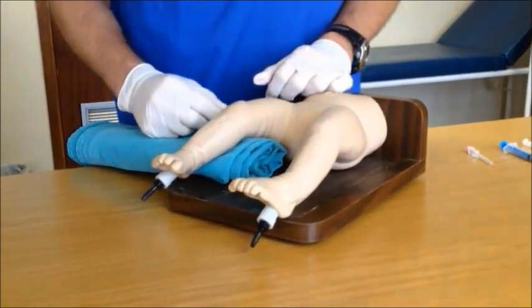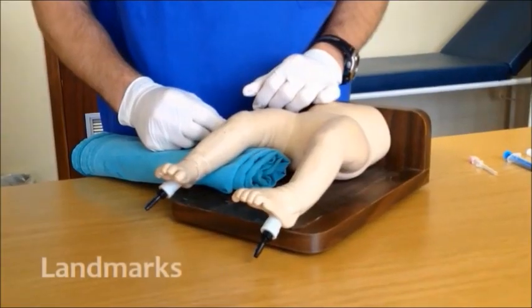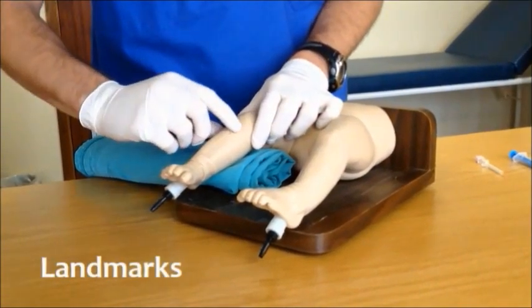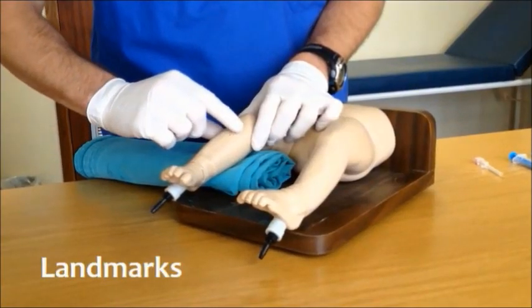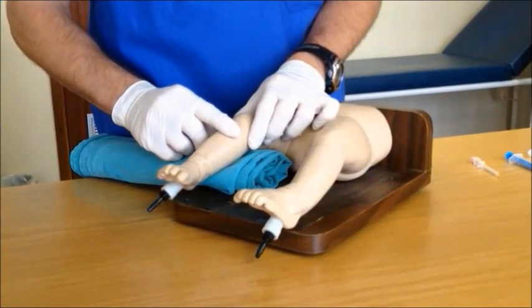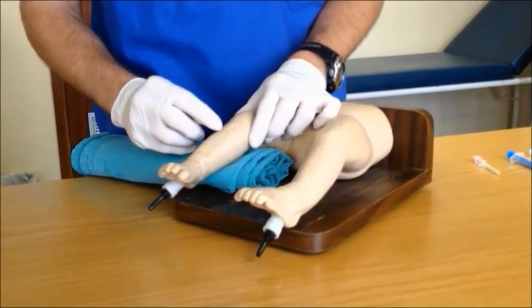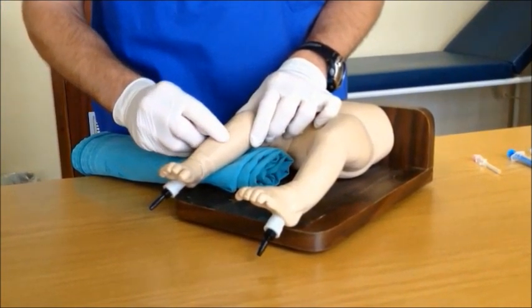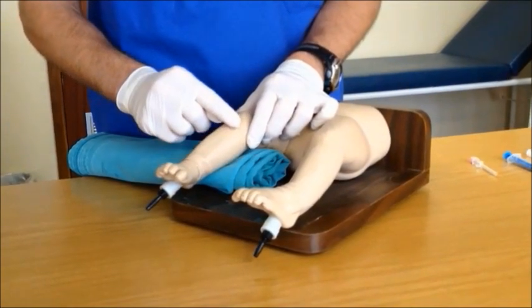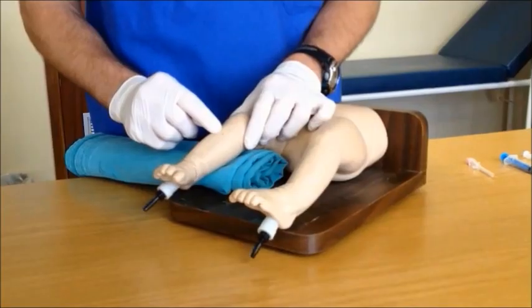The second step would be to identify the correct area of insertion. Grab the knee firmly and palpate for the proximal end of the tibia. The area where intraosseous access should be gained is about one finger breadth distal to that on the anteromedial flat surface of the tibia. Please take care not to insert the needle too close to the knee, as damage to the growth plate may ensue.